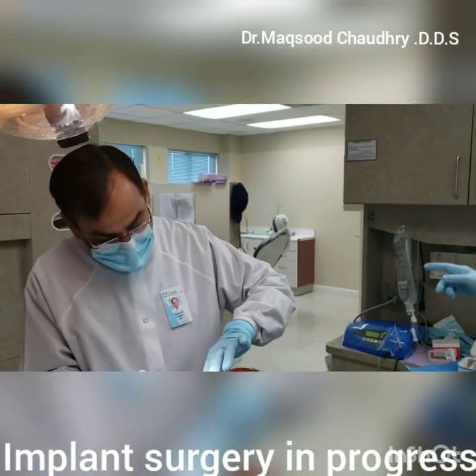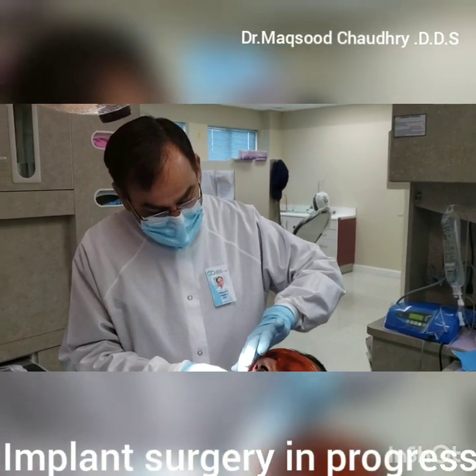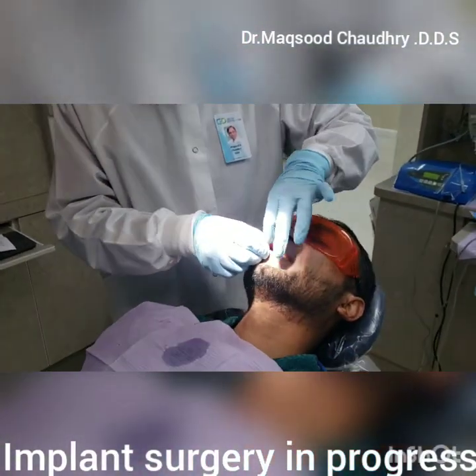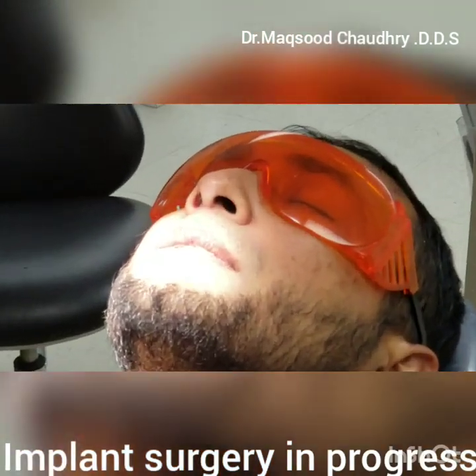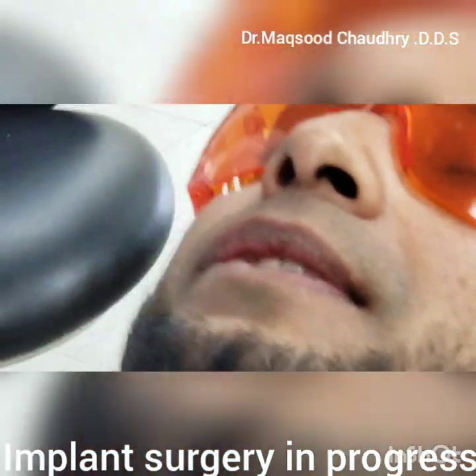Do the X-ray. You close your mouth. We'll take one X-ray.